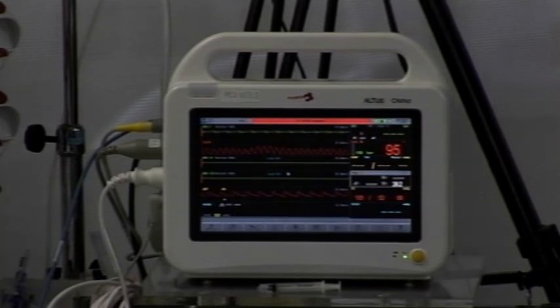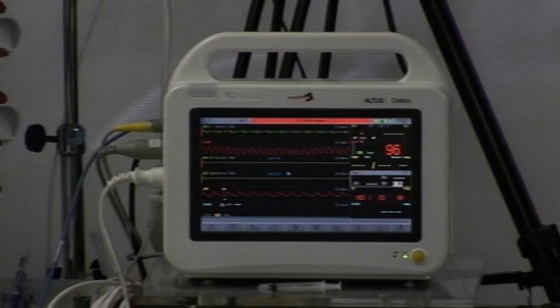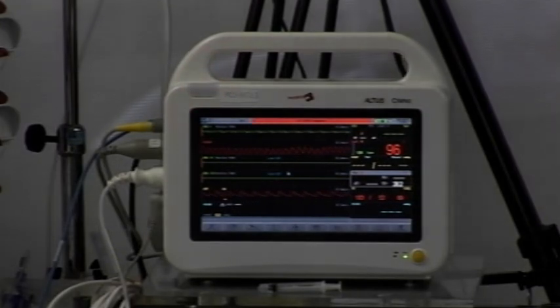You see that? Extremely rapid. So when you suspect overdistension, don't go from 25 down to 24.5 and then down to 24. Decrease. You have to see something. If you don't see something, it's not overdistension. Okay?